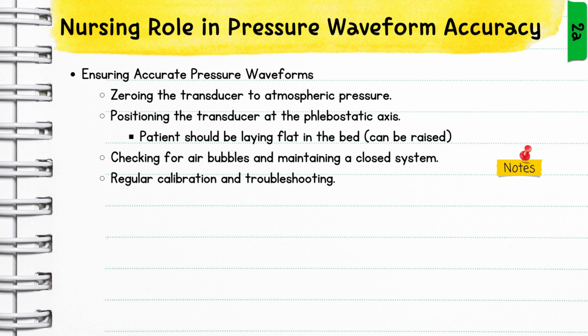You will be trained wherever you go to work on how to do this based on your specific monitors and cables and what equipment is actually in your facility. So don't worry about those specifics. Just remember, you always zero it out before you hook it up.